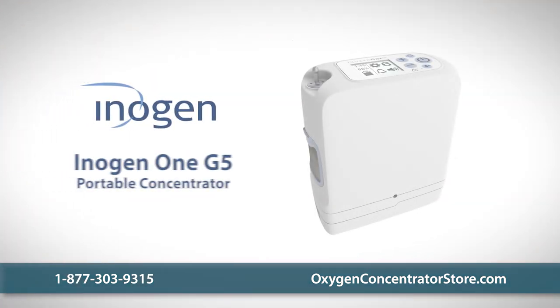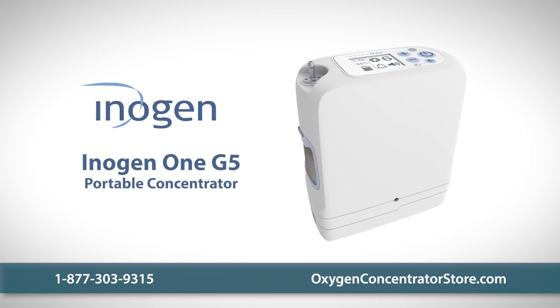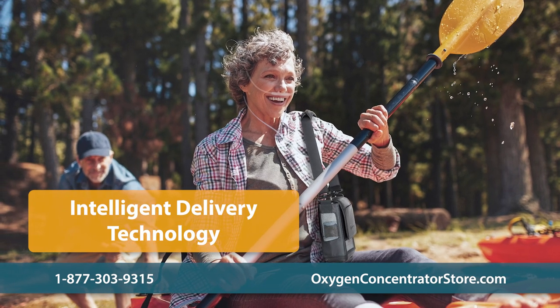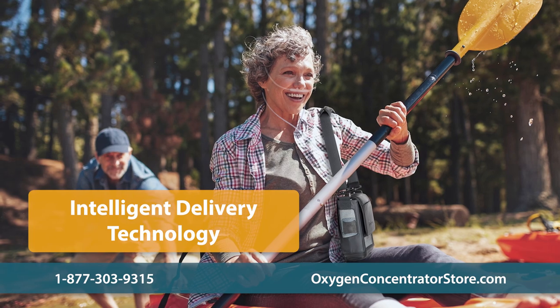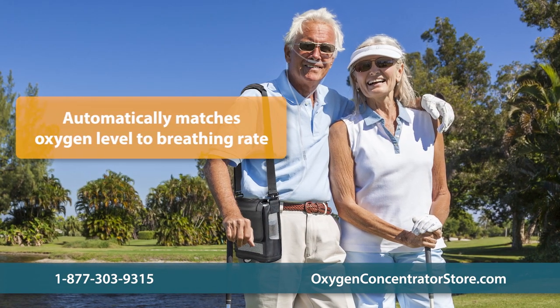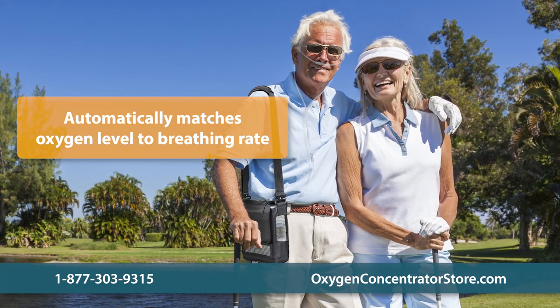The Inogen 1 G5 is the newest machine in the award-winning line of Inogen Portable Concentrators. Utilizing Inogen's intelligent delivery technology, the G5 ensures oxygen therapy is efficiently delivered in all settings. The unit precisely detects breathing rate and adjusts oxygen levels accordingly to deliver the desired oxygen volume every minute.